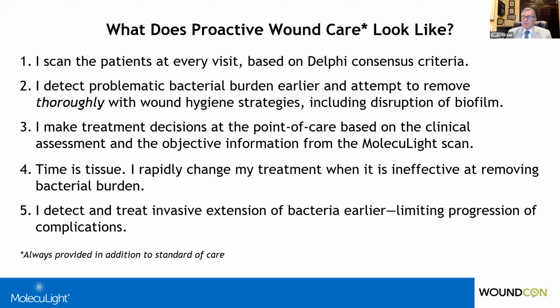Many times when we have undermining or callus of interest, we'll scan, and if you can see the bacteria, that's great. But sometimes after we debride or after we're able to get better visualization of that tunneling, then we can actually see the bacteria. It's important with deep tunneling. Certainly, there may be bacteria in that tunnel that we can't see with the MolecuLight.